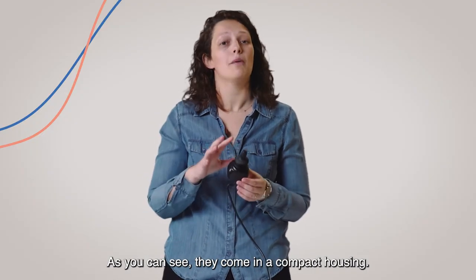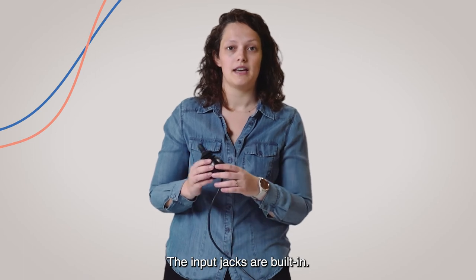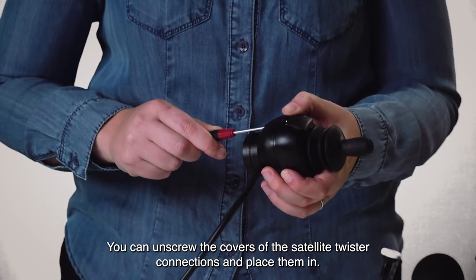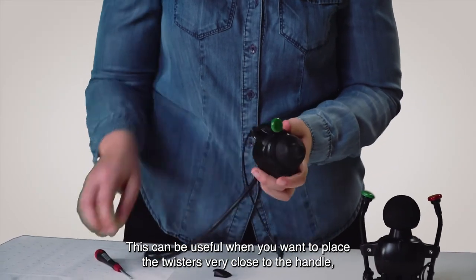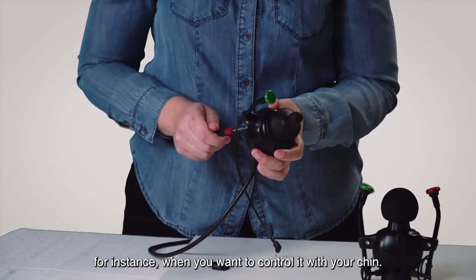As you can see, they come in a compact housing. The input jacks are built in. In the default forward position, the USB connection points towards the user. You can unscrew the covers of the satellite twister connections and place them in — this can be useful when you want to place the twisters very close to the handle, for instance, when you want to control it with your chin.